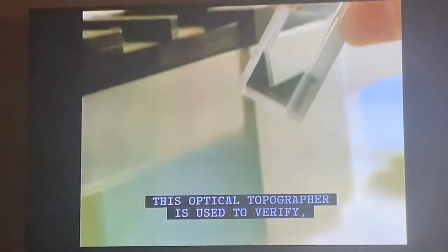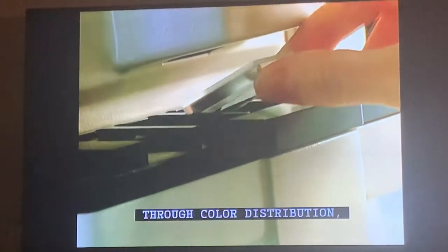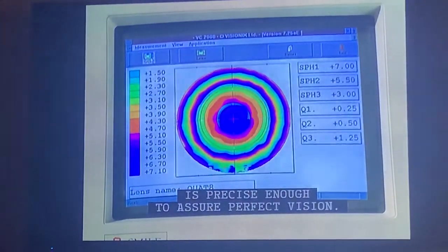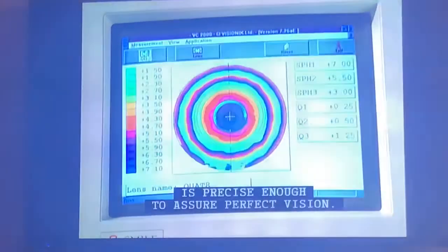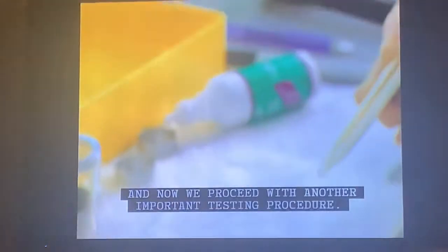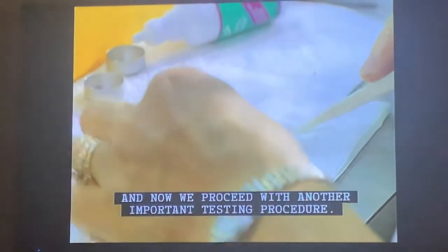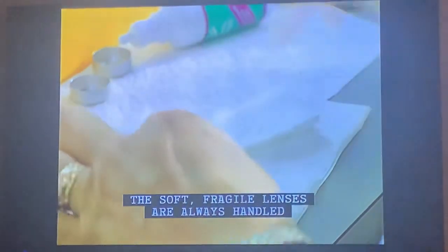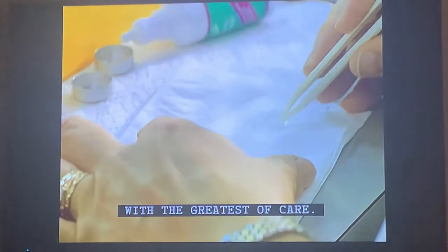Optical topography is used to verify through color distribution whether the spread of optical power in the lens is precise enough to assure perfect vision. Another important testing procedure follows — the soft, fragile lenses are always handled with the greatest of care.